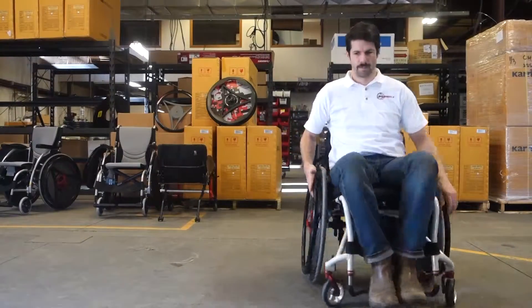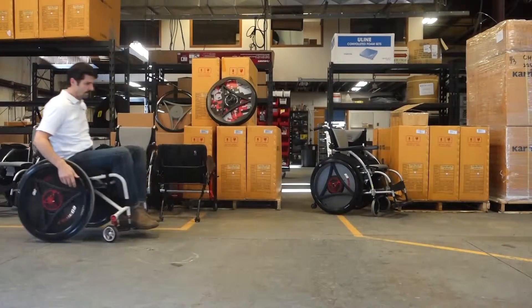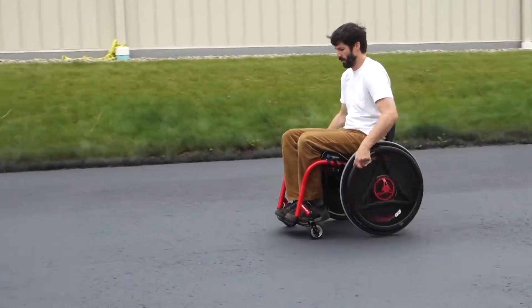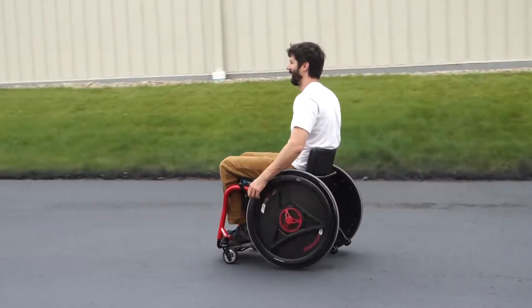As with standard wheels, you can also turn by pulling more or harder on just one of the hand rims. Using these techniques will help you quickly become familiar with the rowing motion.